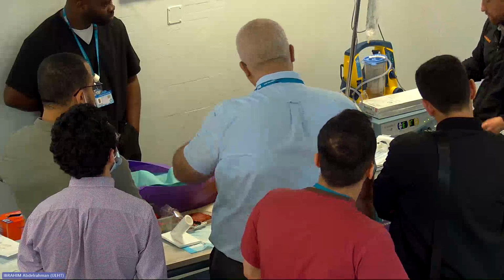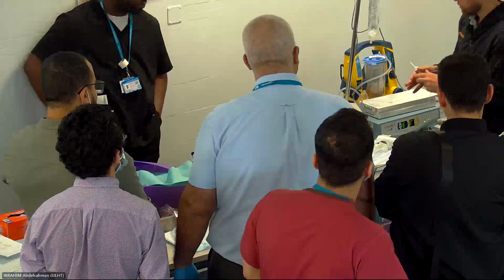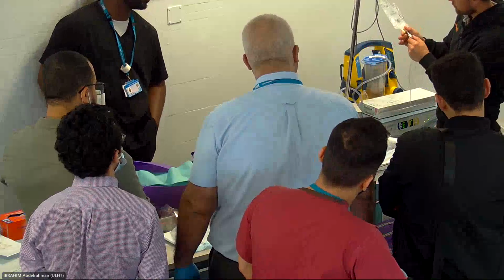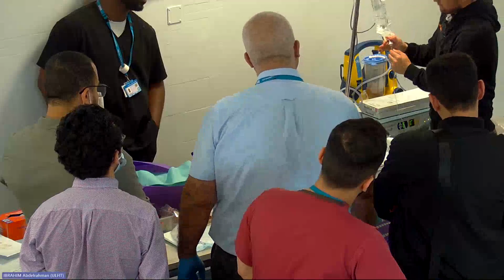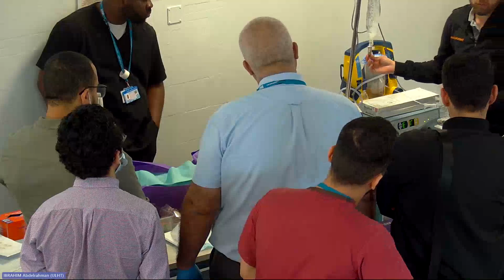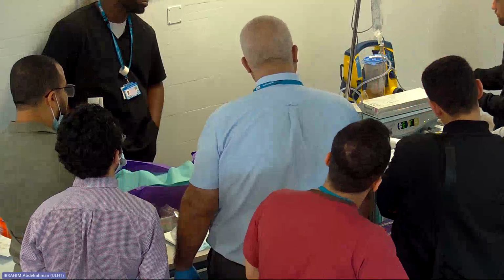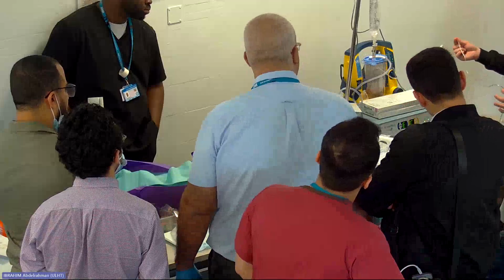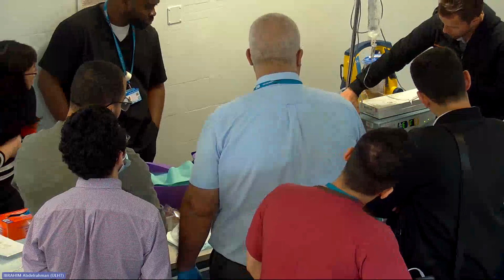I'll leave it up here for now. But the first thing I do is close it off completely to avoid saline going where it shouldn't. Squeeze the bag and leave it about half full, because you want to be able to look at this to set your flow rate. Don't look at the tip of the wand, and I'll show you why in a second. Always look up here. Now, the last thing, this is the thing I've been getting to that you need to remember, and this is what they mess up.